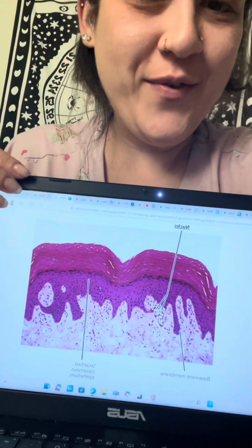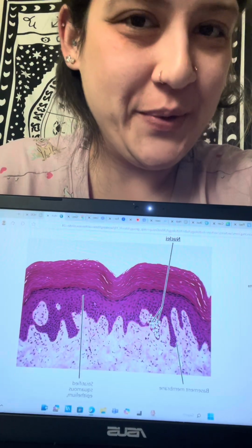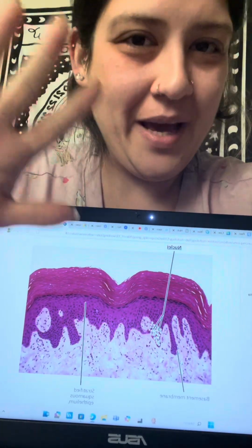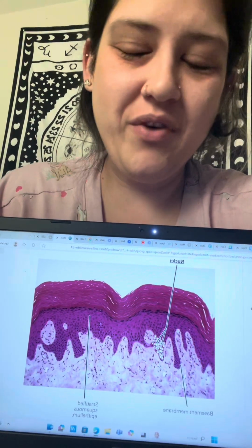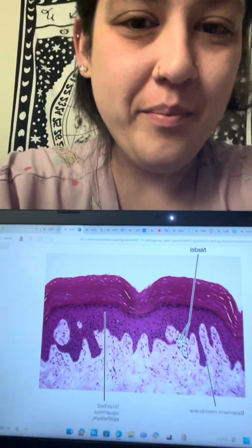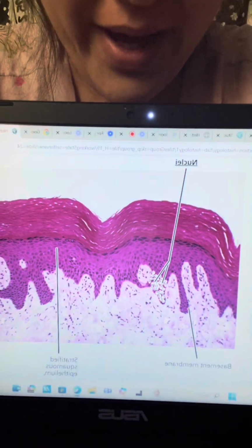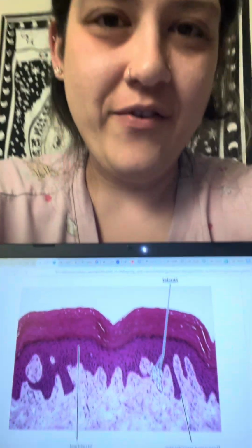I apologize for my makeshift video. My laptop was having some issues recording and putting my face over the image like a screen recording, so I had to resort to this, unfortunately. But hopefully I will make the image as clear as possible while relating the information.